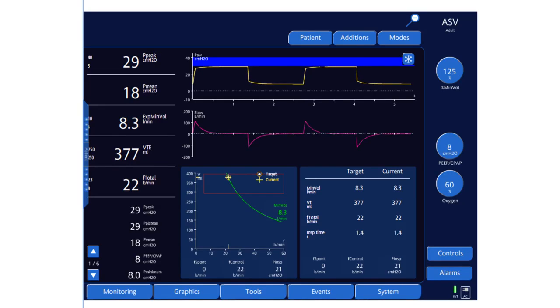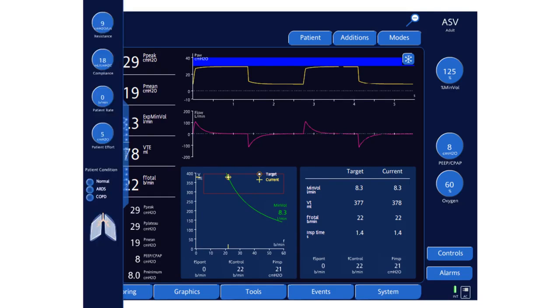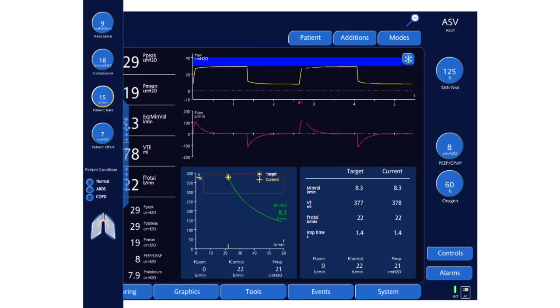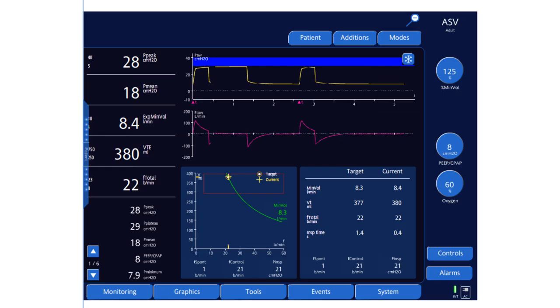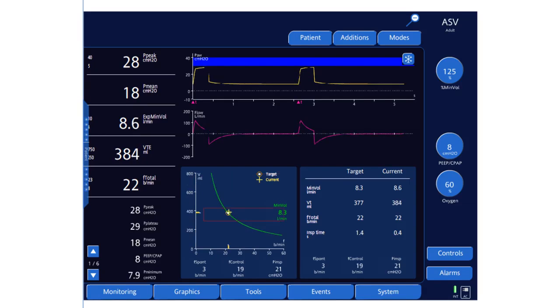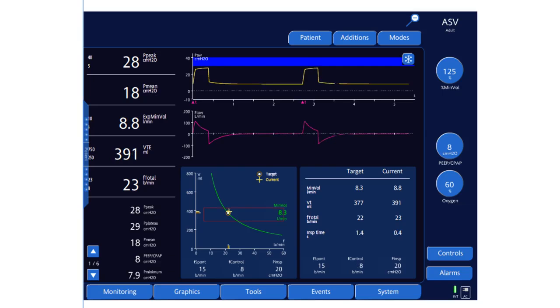Now, if the patient starts to breathe, he will transition from PRVC into volume support. Let's increase the spontaneous inspiratory rate. You can see how he started to breathe — the breath changes from pressure control (PRVC) to volume support or pressure support.